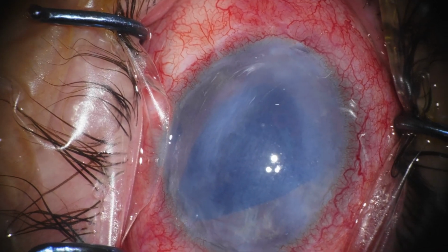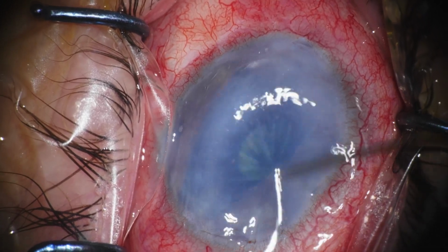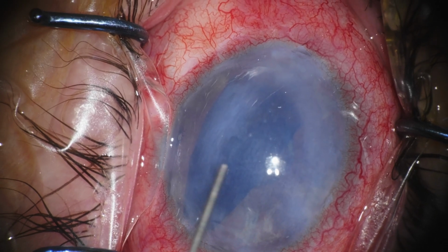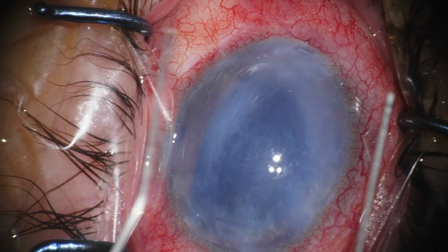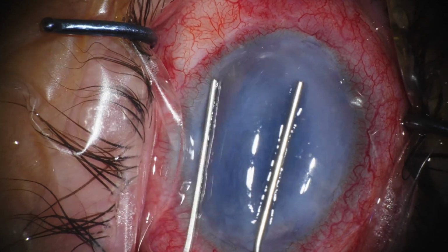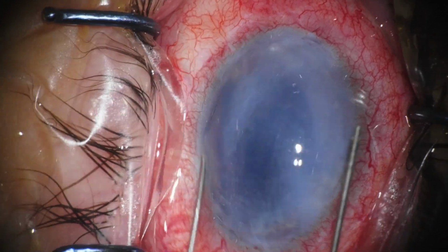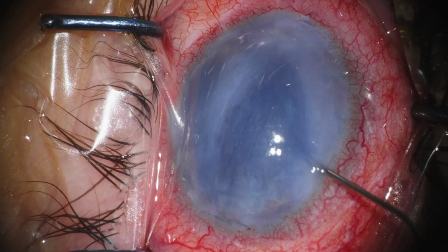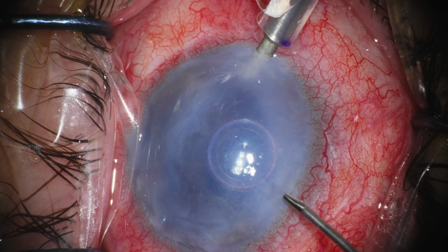And now we can appreciate the S mark, so we know that the graft is right side up. Now with a few shuffling bumps, we try to get it in position and then to unfold it in position. This is key in DMEK, to not unfold the graft in the angle, because if you do, it'll get stuck there and you'll probably need to resort to direct manipulation, meaning pulling the graft with a coaxial forceps.